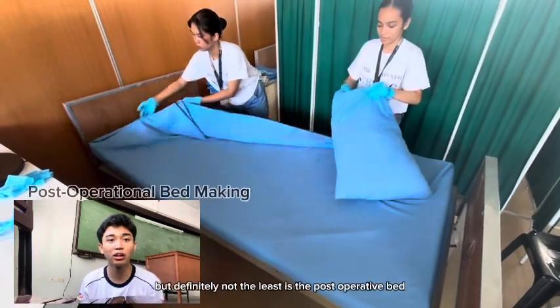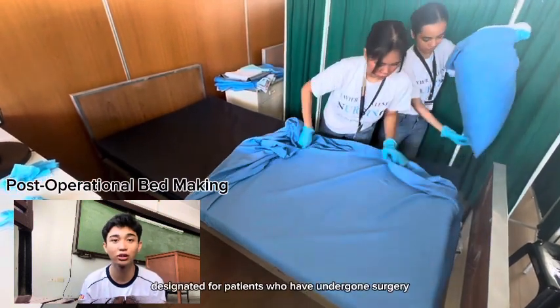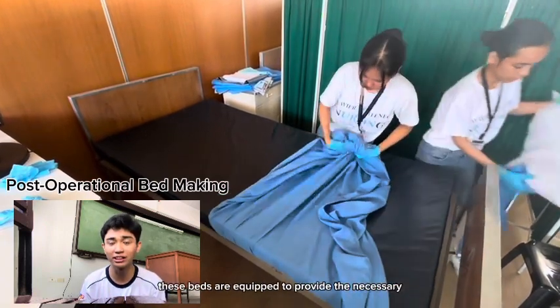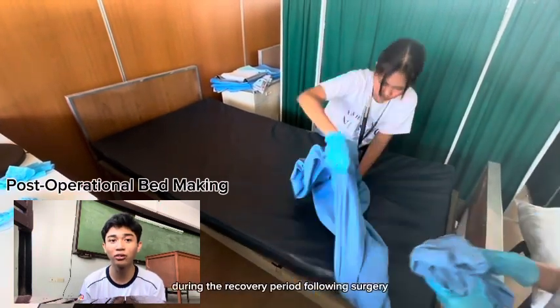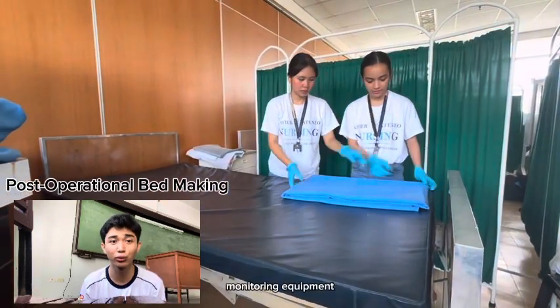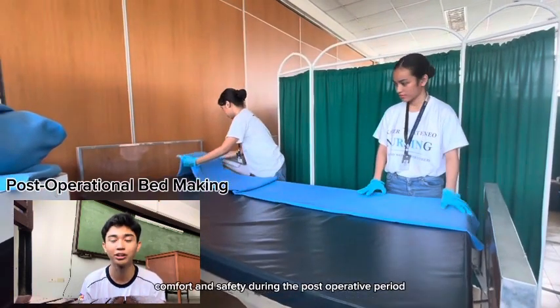Last but definitely not the least is the post-operative bed. This refers to a hospital bed specifically designated for patients who have undergone surgery and are in the post-operative phase. These beds are equipped to provide the necessary nursing care, monitoring, and support needed during the recovery period following surgery. They may include features such as adjustable positions, monitoring equipment, and specialized mattresses to ensure the patient's comfort and safety during the post-operative period.